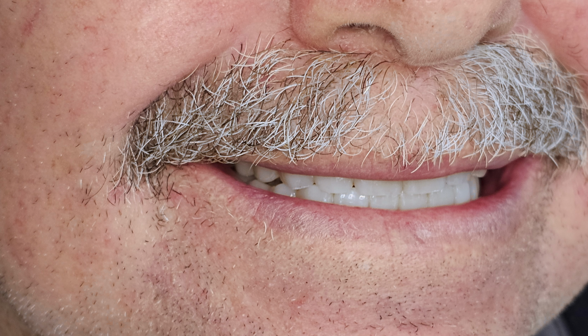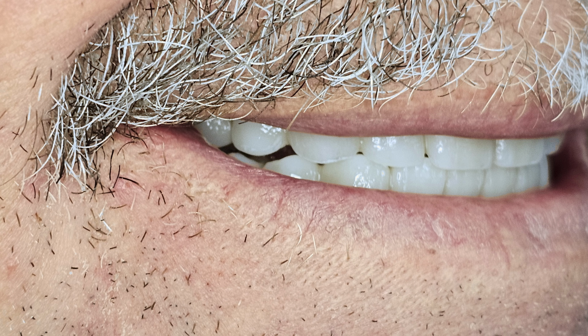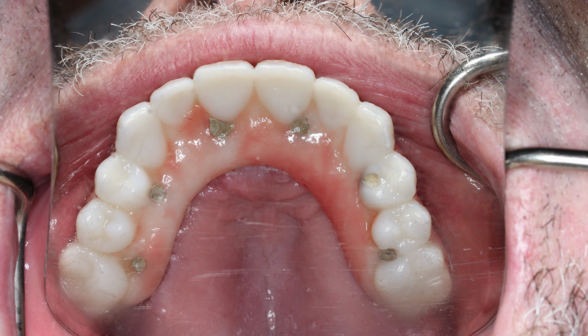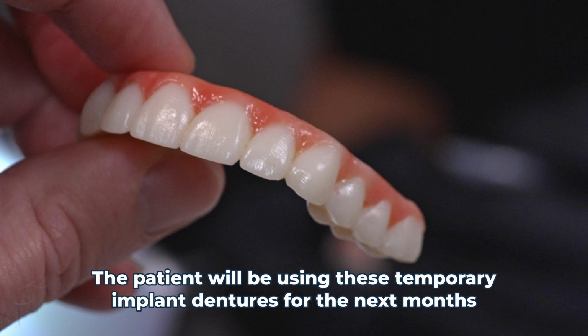So we finally ended with the surgery with the temporary dentures in place. And here are a few pictures of what they look like right away. But the patient loves the way they look right off the bat. Now, on the back side of these dentures is hidden and sealed off where we screwed in the prosthesis into the MU abutments. The patient uses these provisional dentures for a few months.